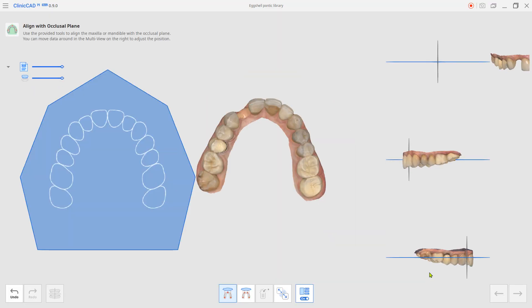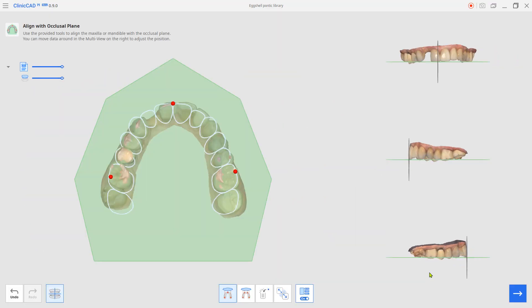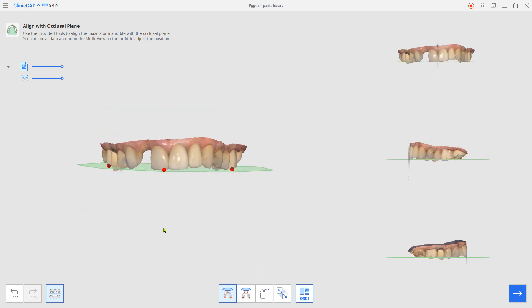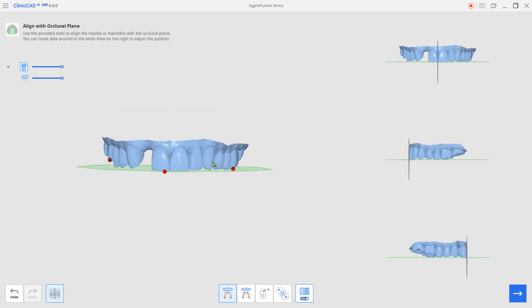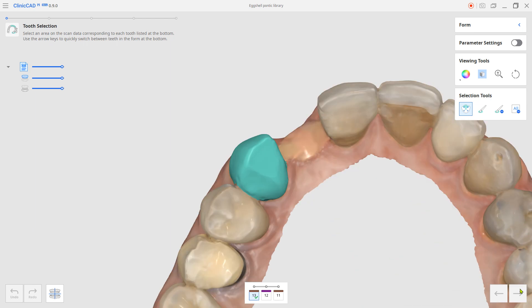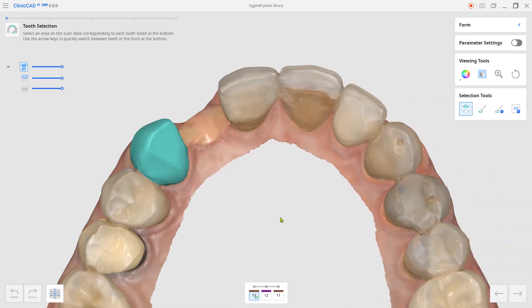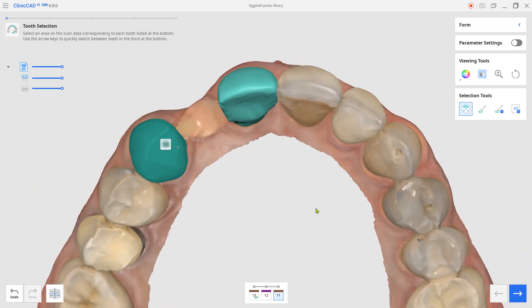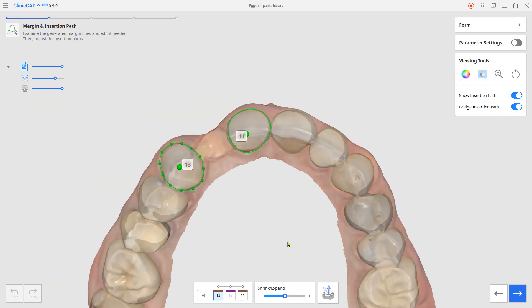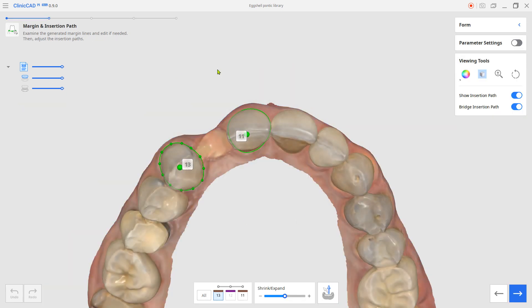The system will automatically align the data over the virtual occlusal plane. Designate teeth along the tooth number at the bottom. Adjust the margin and insertion path if needed.